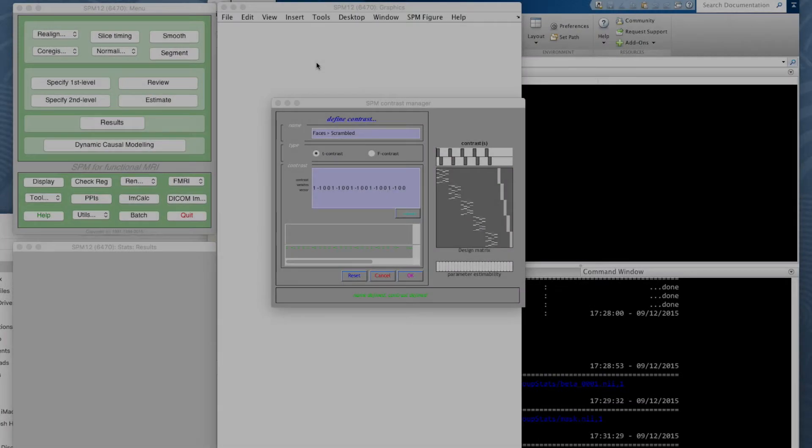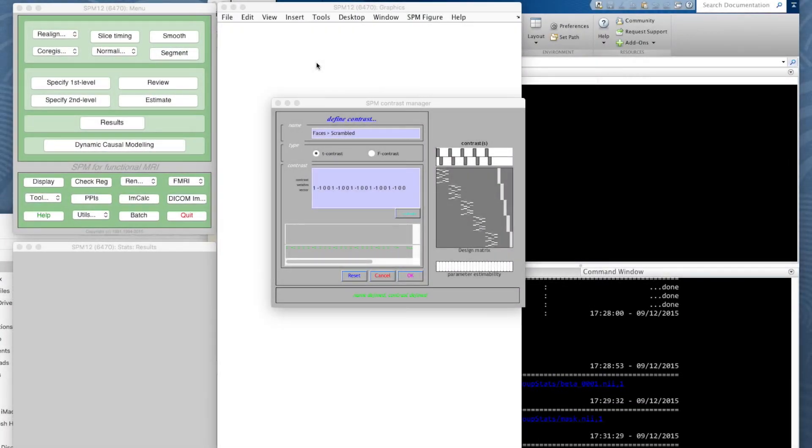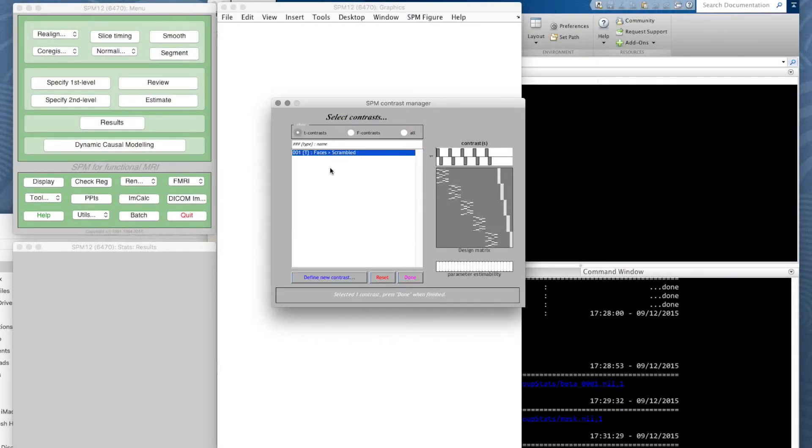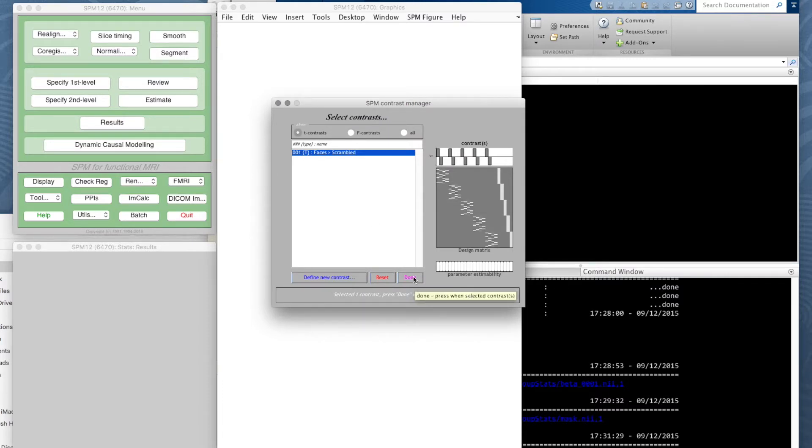We're going to define a lot more contrasts, but for now we'll stick with just this single one we've got, which should show us those voxels more activated by faces than by scramble. Let's click done on that.